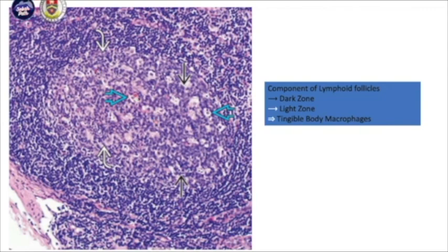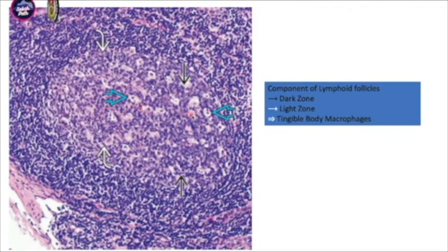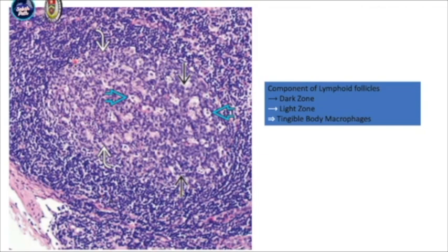If you see a distinct light zone and dark zone, these are the characteristics of a benign lymph node together with tingible body macrophages. Usually this lymph node is rimmed by a well-defined mantle zone, which is composed of mature lymphocytes.